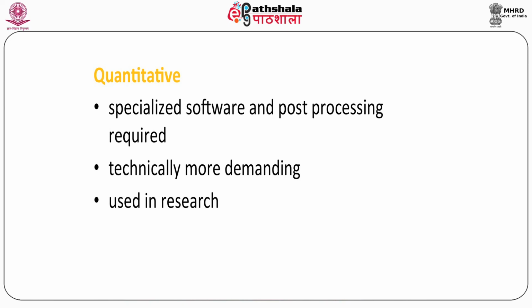Quantitative analysis. Quantitative analysis is not routinely used in clinical practice. This requires specialized software and post-processing. It is technically more demanding and predominantly used in research facilities.